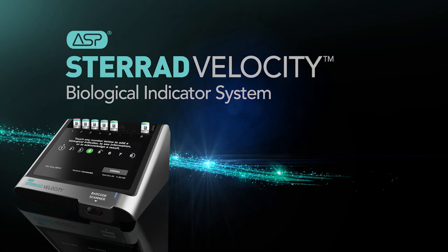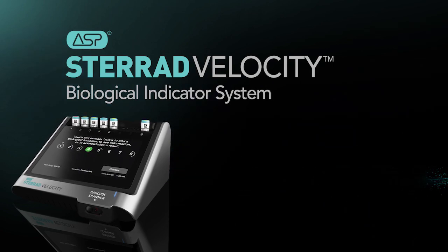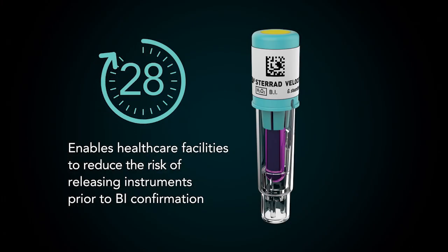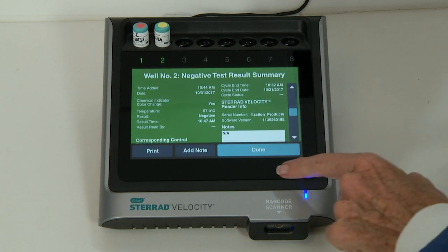The STERAD Velocity Biological Indicator System offers advanced, reliable technology with results read out in just 30 minutes. In this video, we will provide an overview for its use.